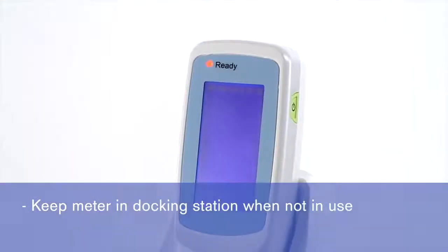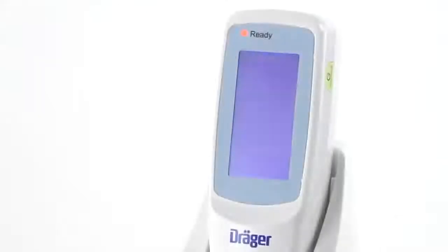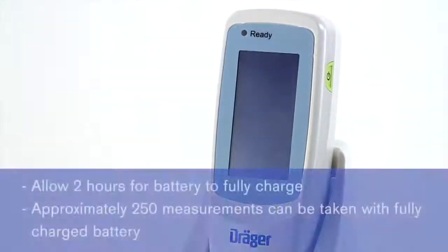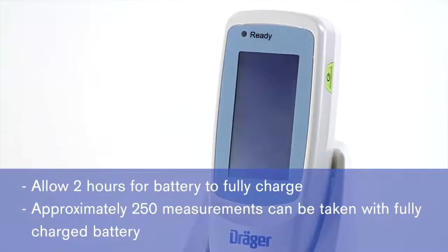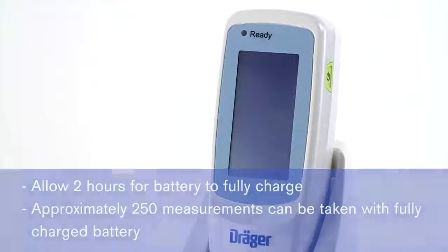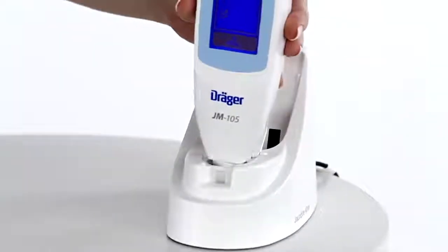When placed in the docking station, the power comes on and the ready lamp turns orange. When charging is complete, the orange ready lamp shuts off. The JM105 requires 2 hours for the battery to fully charge. With a fully charged battery, approximately 250 measurements can be taken. We will now demonstrate how to use the JM105, beginning with how to check the light output of the measuring probe.